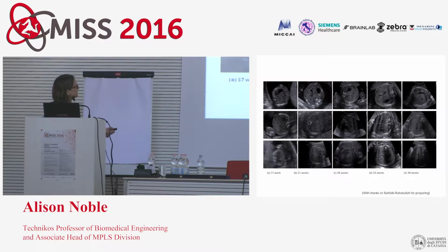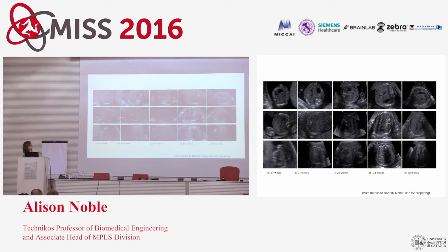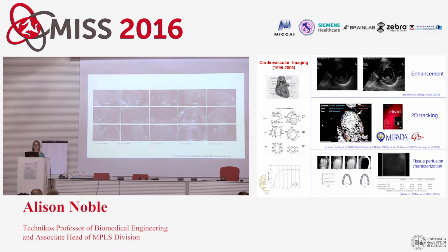You go from data in typical clinical use, from being high quality to medium quality to then the data when it's impossible to interpret. The challenge we have today is that most clinical publications will be analyzing data only on this top line. So all the reports you get of typical research in this area are from the best quality scans. If we're to get tools used in the clinic, we at least have to work on medium quality data. And so what we try and do is work with data within these two rows, be able to get methods that are robust enough to work in that scenario.